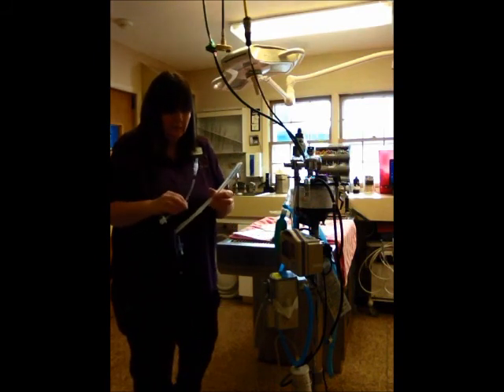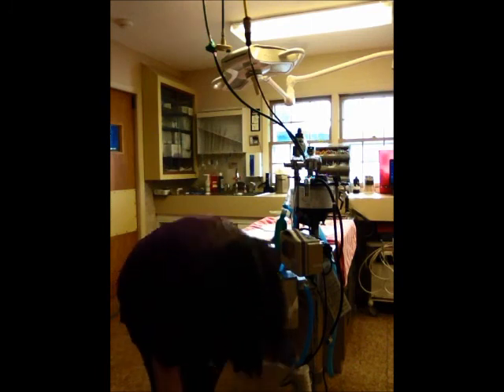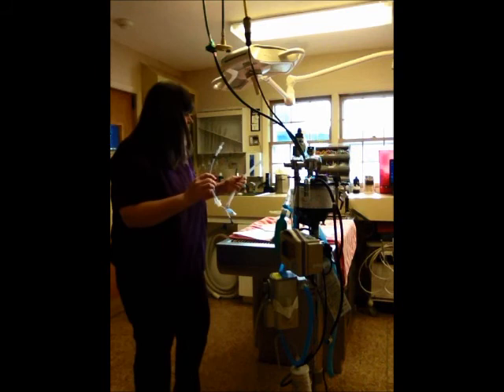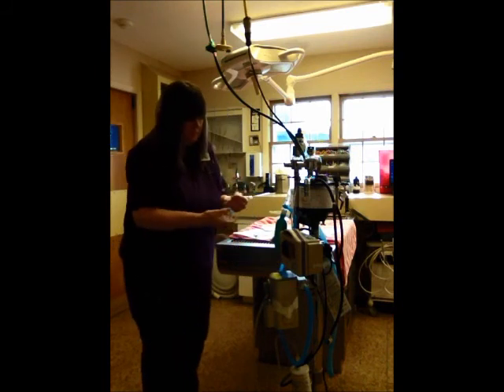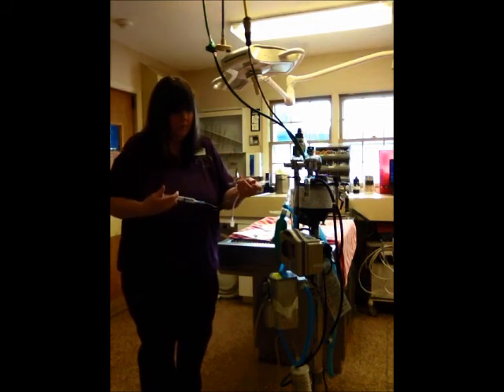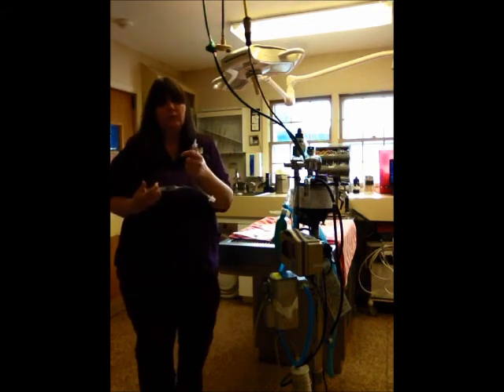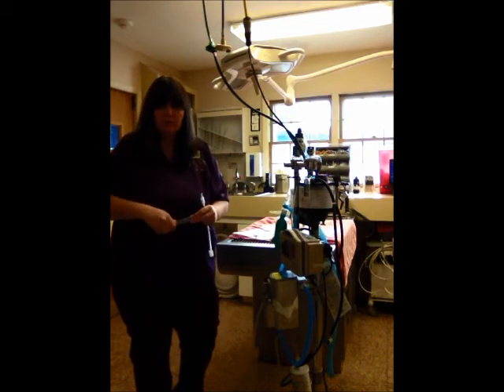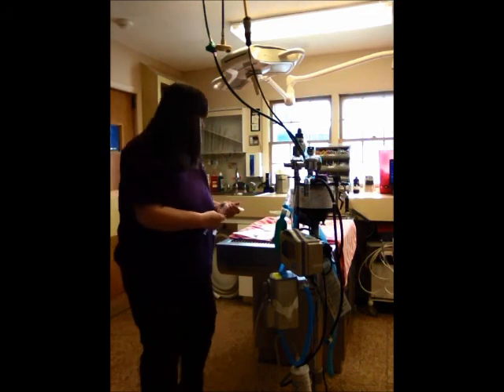Different E-tubes, and these are going to go down their throat. The cuff seals, blow the cuff up, and the cuff seals in their throat so that they have a nice seal, allowing the anesthetic gas to do its job and keep them sedated. E-tubes also determine what size to use on what patient. There is a weight chart you can use. It does come with some experience.